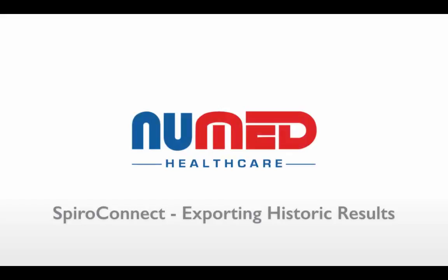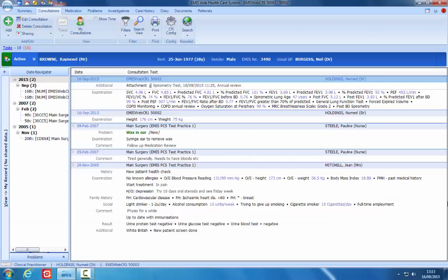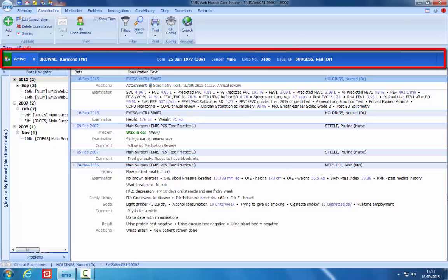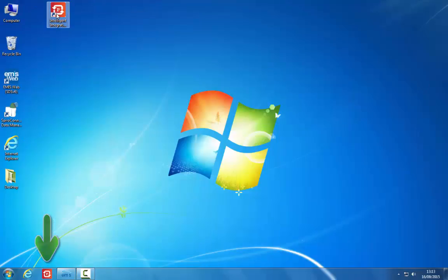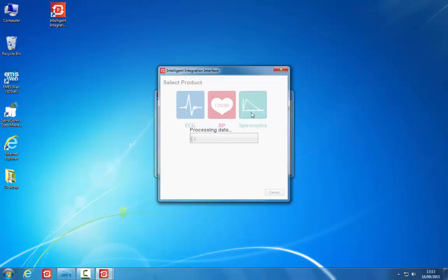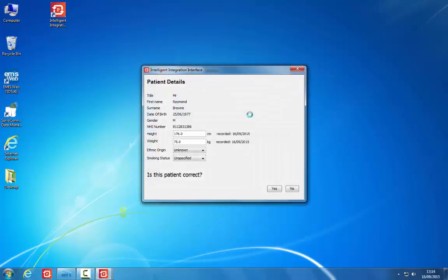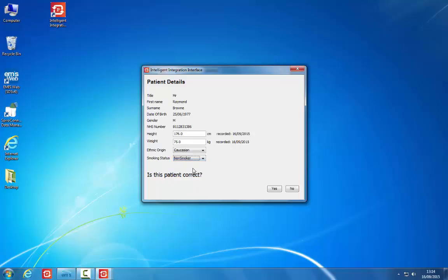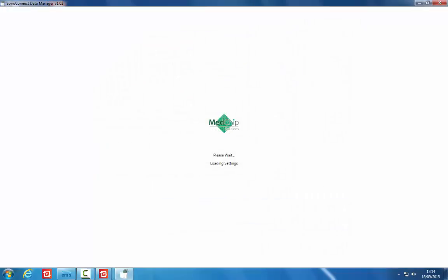Exporting Historic Results. Normally, results will be exported and filed to the patient record at the time the tests are performed. It is also possible to export and file historic results to the clinical system. Load the patient record in the clinical system and click the i3 icon on your taskbar or desktop. Click the Start button, then click the spirometry icon. i3 will connect to the clinical system and pull through the active patient's details. Ensure all details are correct, updating as necessary, then click Yes to proceed.